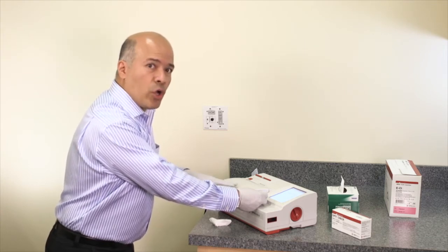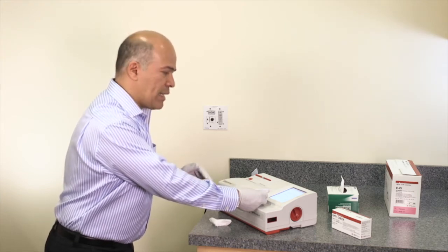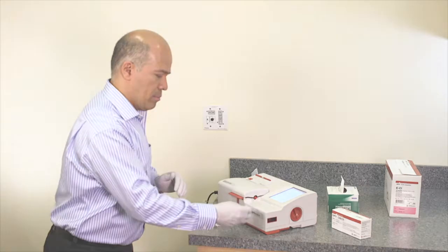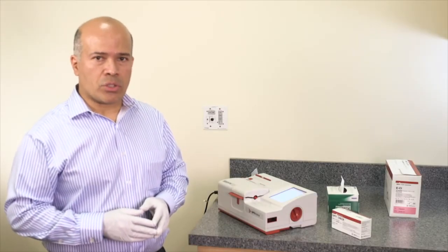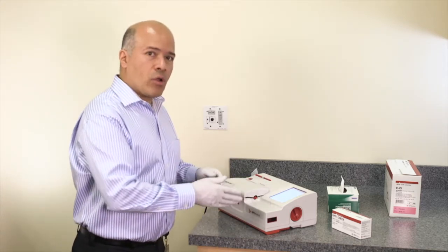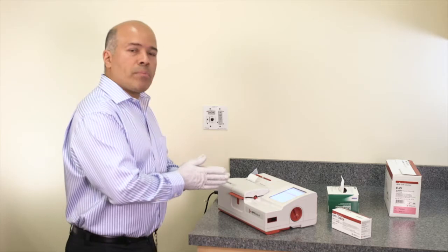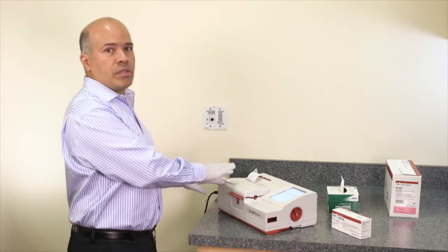The instrument takes the volume it needs for the measurement. Once the cassette takes the required volume, the analyzer begins the measurement and prompts the user that the test has started. Once the quality control tests finish, the results are shown on the screen. The user must verify that all analytes pass. Once results are accepted, the instrument prompts the user to remove the cassette, and the results are printed on the printer.